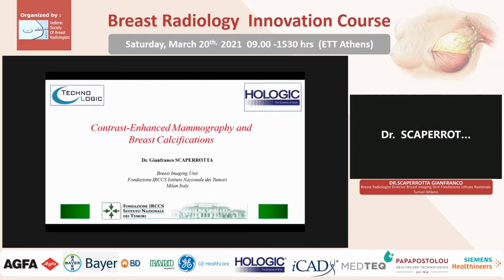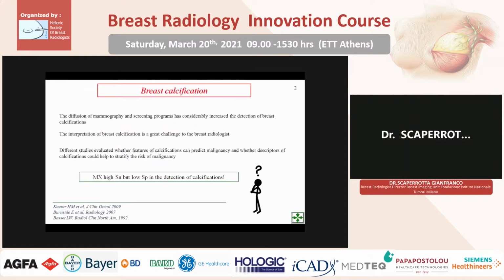I repeat, I work in the National Cancer Institute of Milan, and I will speak about our experience. We know that the diffusion of mammography and screening programs has considerably increased the detection of breast calcifications, but the interpretation remains a great challenge to all breast radiologists.